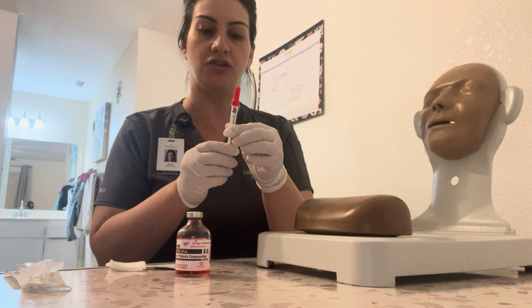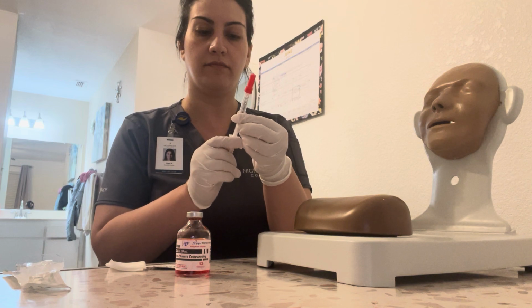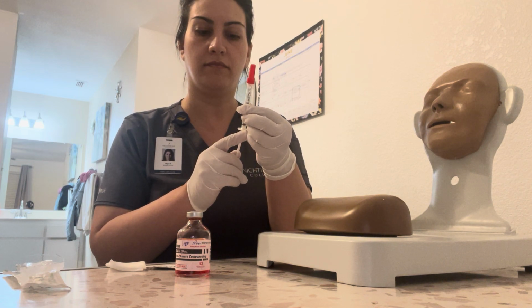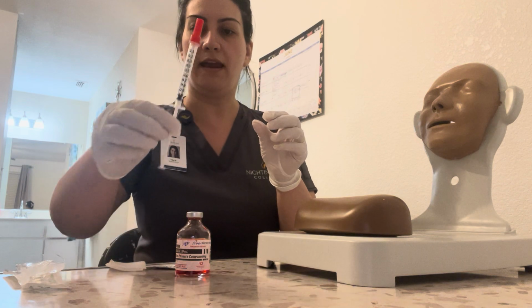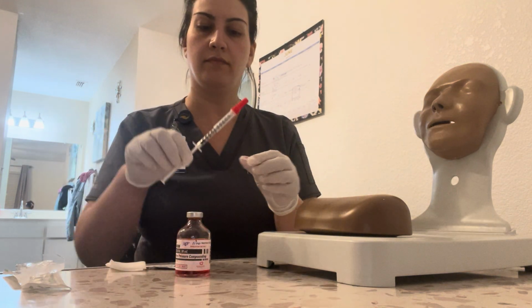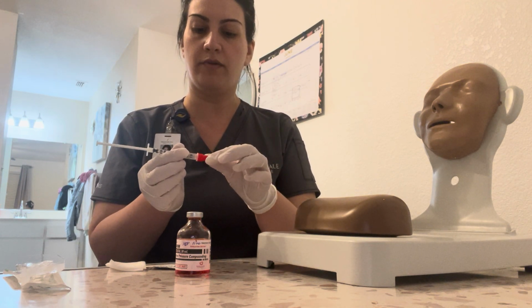We're going to inject air of 1 milliliter. One milliliter of air. Next, we want to go ahead and use these 2 fingers, and we're going to take off the cap.